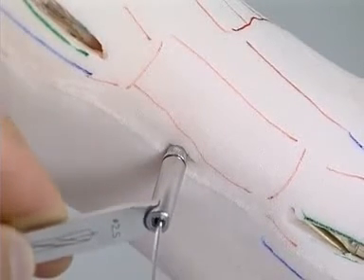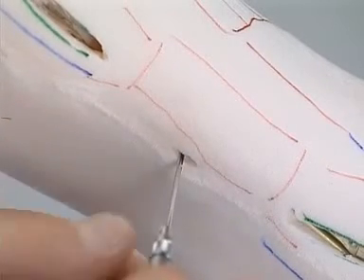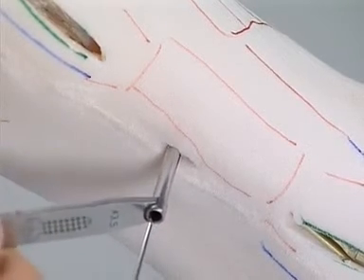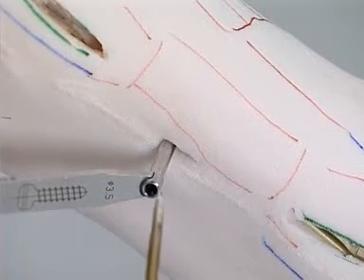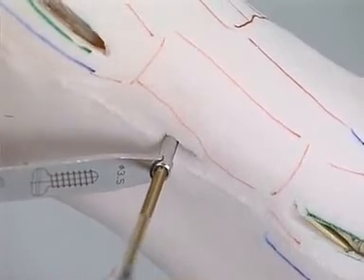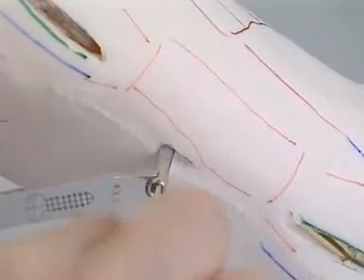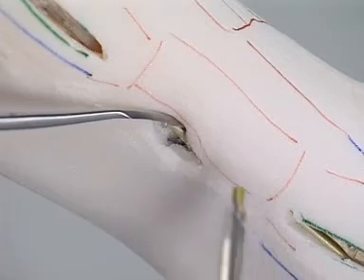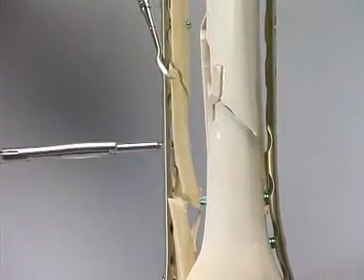The hole in the plate and the drill hole in the bone can be marked by means of a K-wire. The drill guide is now rotated and slid over this wire, enabling the thread to be created with the 3.5 mm tap for cortex screws. The selected cortex screw is inserted, so that the intermediate fragment can be drawn onto the plate and fixed.